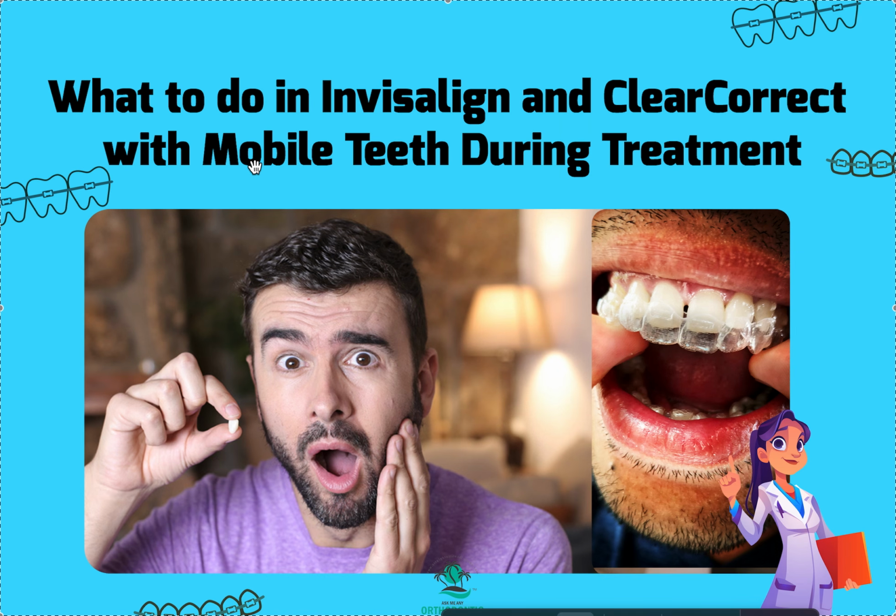So I'm going to take a progress PA, make sure things are tightening up, make sure we're still out of occlusion, and then maybe I'll go ahead and refine with those things in mind, slowing down the treatment plan by 3 times, making sure those teeth are not in occlusion, and making sure we're not proclining or round tripping. And usually it works out okay. But if you talk to any periodontist that's out there, they're going to say, sometimes you have to stop treatment, and that's just how it is, or stop treatment in that arch.